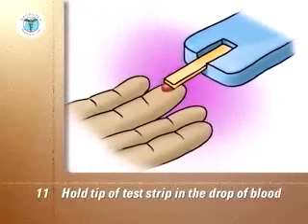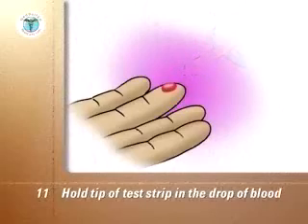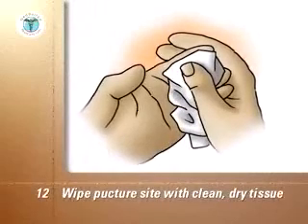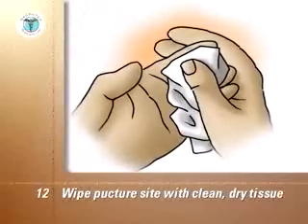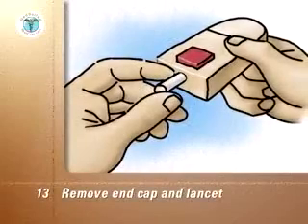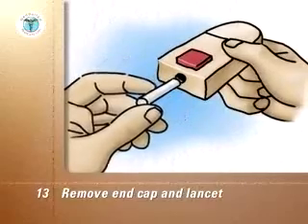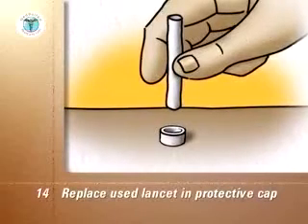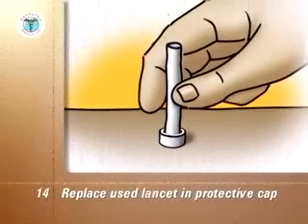Remove the test strip from the blood. Put the device and the strip aside until the reading is complete. Wipe the puncture site with a clean, dry facial tissue and use the tissue to hold pressure on the puncture site until the bleeding stops. Remove the end cap from the lancing device and remove the used lancet. Replace the used lancet back into the protective cap by pushing it into the open end of the cap, which is placed on a firm, flat surface like a countertop.